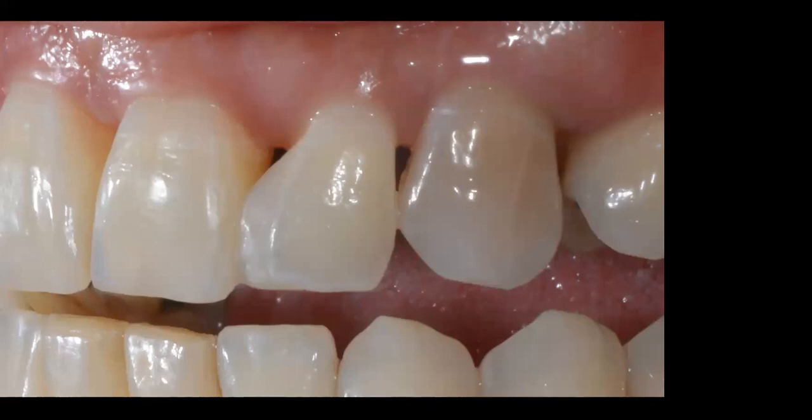If you change the emergence profile equigingivally, you're either going to have an overhang or a black triangle. And so that's been the problem that happened before we had Bioclear. So if we're going to create these beautiful pink and white aesthetics, that emergence profile has to change subgingivally. And we were never able to do that before Bioclear.